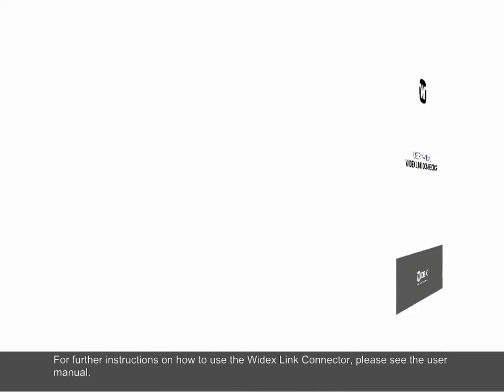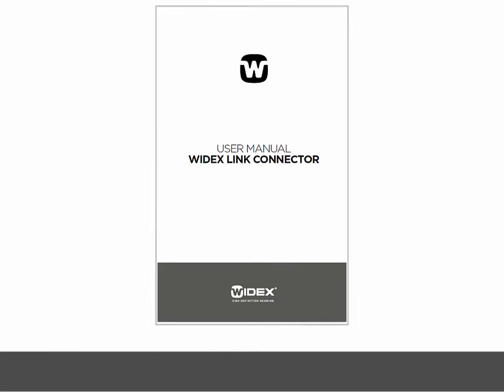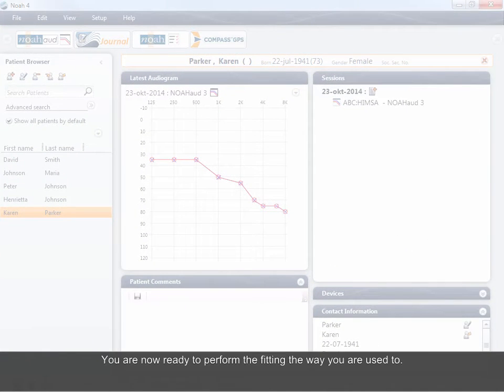For further instructions on how to use the Widex Link Connector, please see the user manual. You are now ready to perform the fitting the way you are used to.